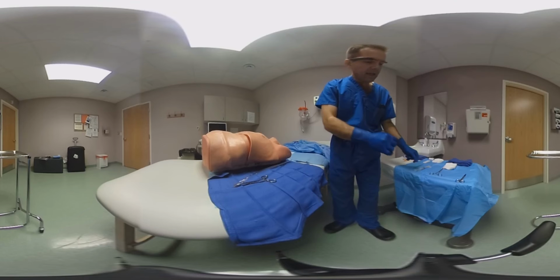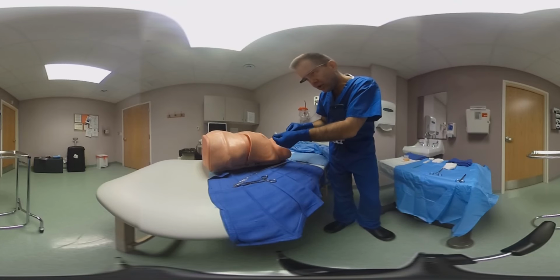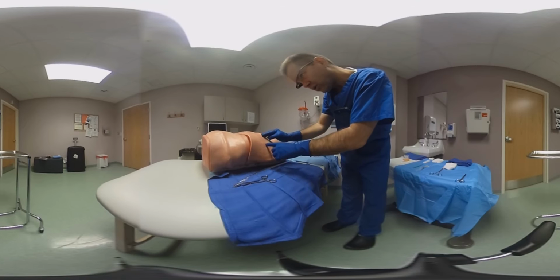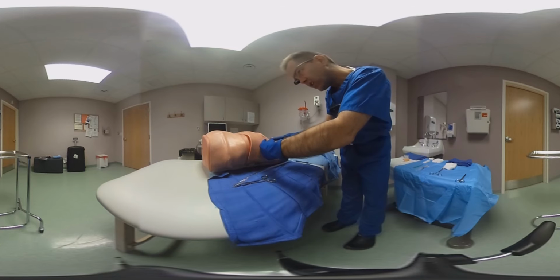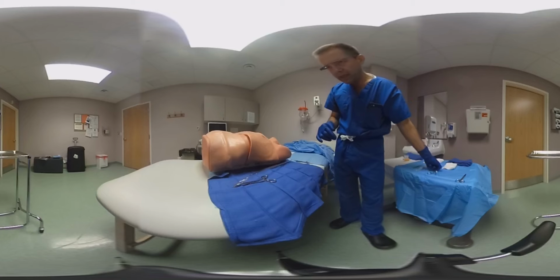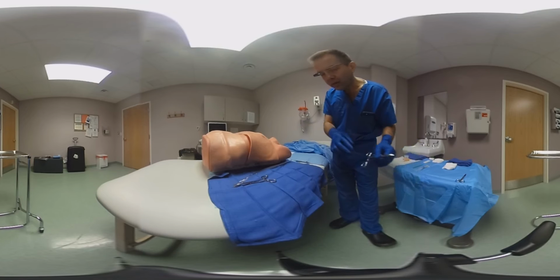In any case, after that, you inject an area which should be in the 4th to 5th intercostal space. You want to inject the area of the intercostal space and focus on the top of the lower rib in order to prevent injury of the neurovascular bundle.